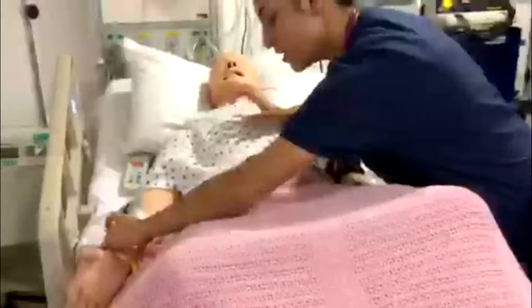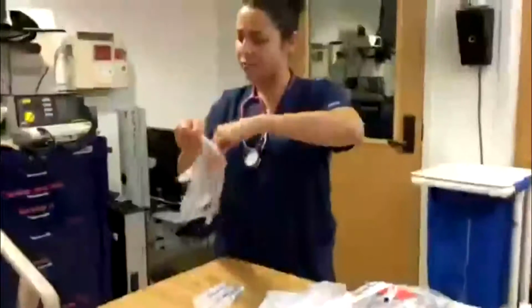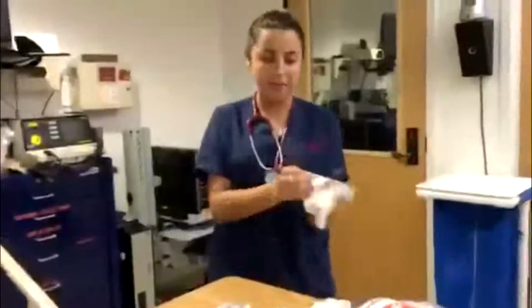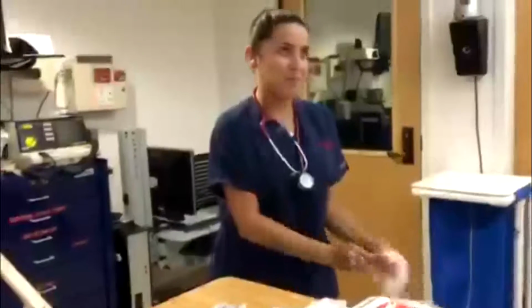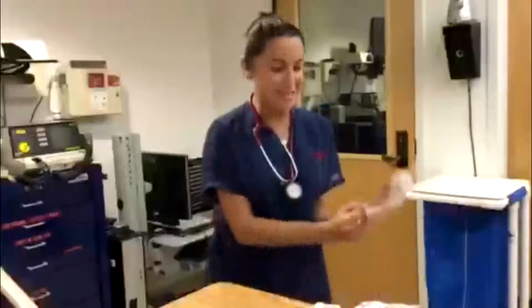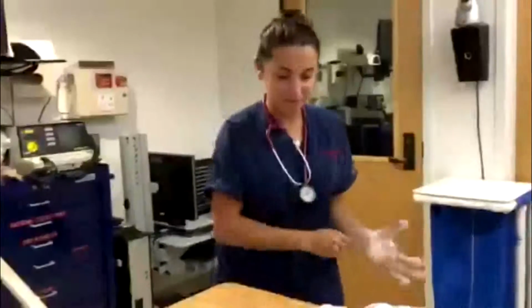Okay, Mr. Sweetheart. Now, I do want to check your IV site, and also if you could just give me your full name and date of birth, please. All right, Bob Sweetheart. Okay. And let me glove up and look at your IV site. Have you been experiencing any pain in that site? Okay. One second. My hands are a little wet, so it's hard to get into the gloves, but I'll get it on. Okay.